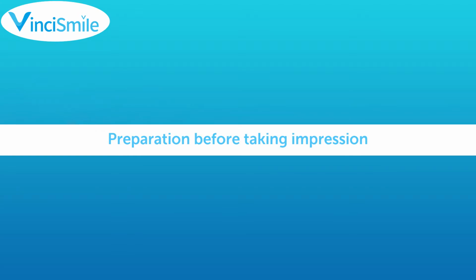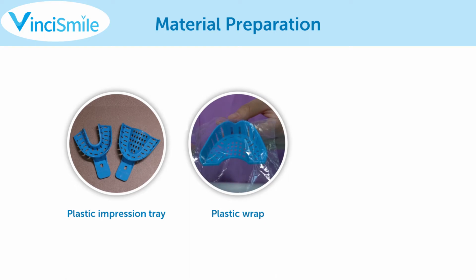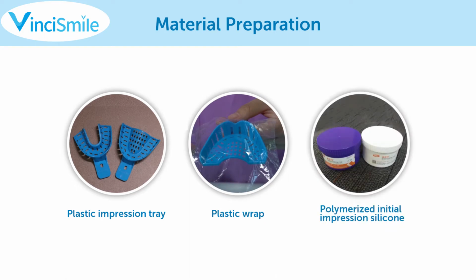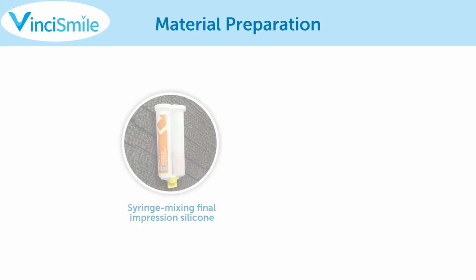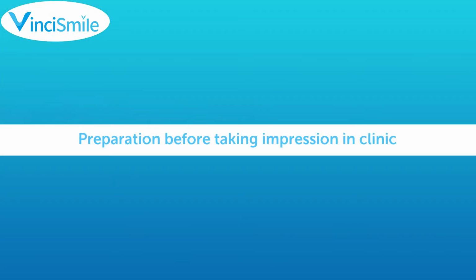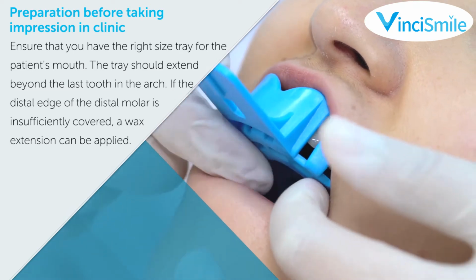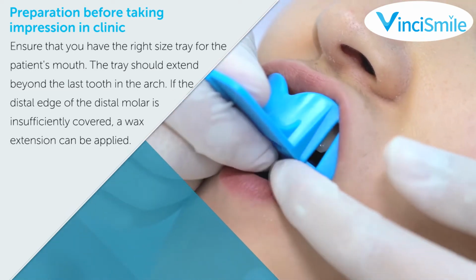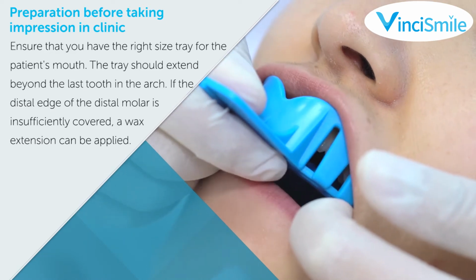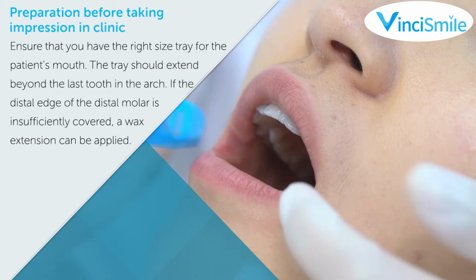Preparation before taking impression: plastic impression tray, plastic wrap, polymerized initial impression silicone, syringe mixing final impression silicone, timer. Preparation before taking impression in clinic. 1. Ensure that you have the right size tray for the patient's mouth. The tray should extend beyond the last tooth in the arch. If the distal edge of the distal molar is insufficiently covered, a wax extension can be applied.